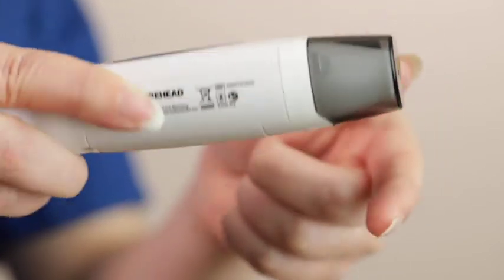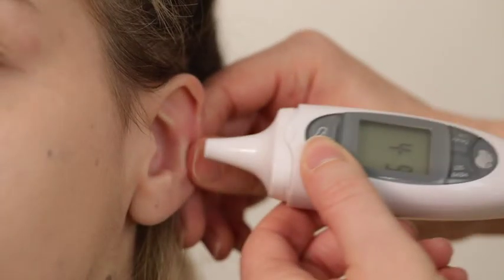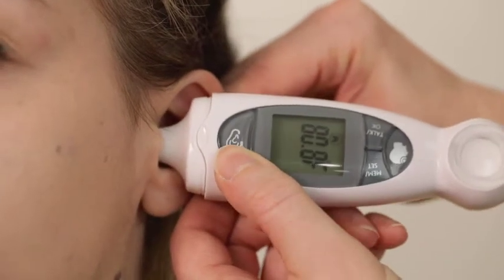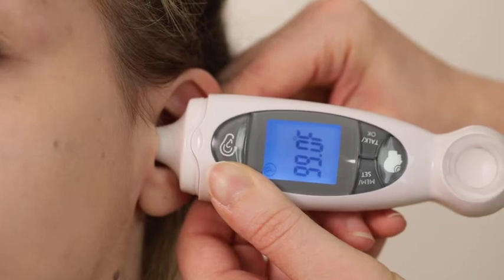To take an ear temperature, remove the forehead adapter and confirm again that the probe and sensor are clean. Insert the probe gently into the ear canal and hold the thermometer so that the probe aims straight at the eardrum. Gently pull the outer ear toward the back of the head to straighten the ear canal. Press the ear button to take the measurement. A beep or a voice announcing the temperature means the measurement is complete.